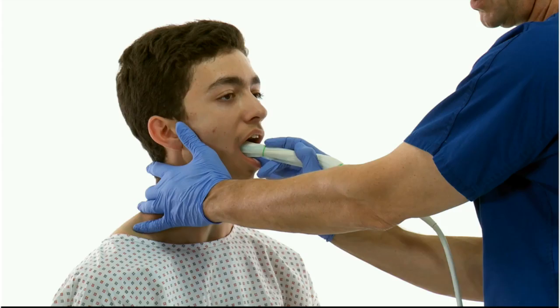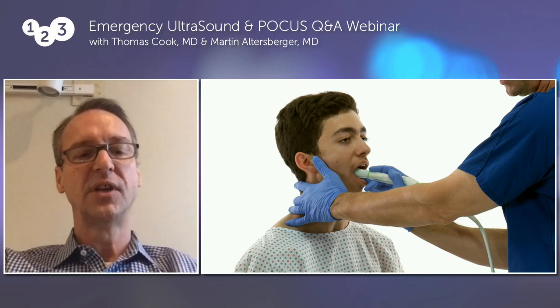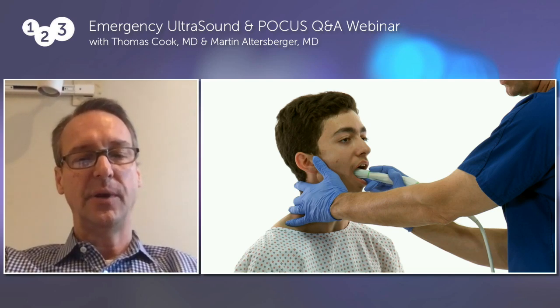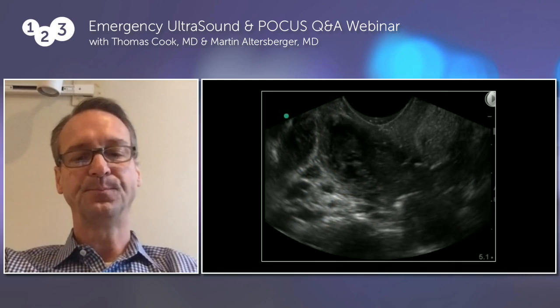Now, the way you'll actually do the exams you see here is you'll hold the transvaginal. There, I said it. You don't say that word. Intracavitary. You're going to hold the transducer and place it in the mouth so the tip of the transducer comes into contact with the pharynx. A lot of patients struggle with this, so you're going to have to negotiate with them to try and remain calm, have them breathe through their nose, and a lot of them will gag, and we'll give you a little tip here in a minute about how to avoid that.